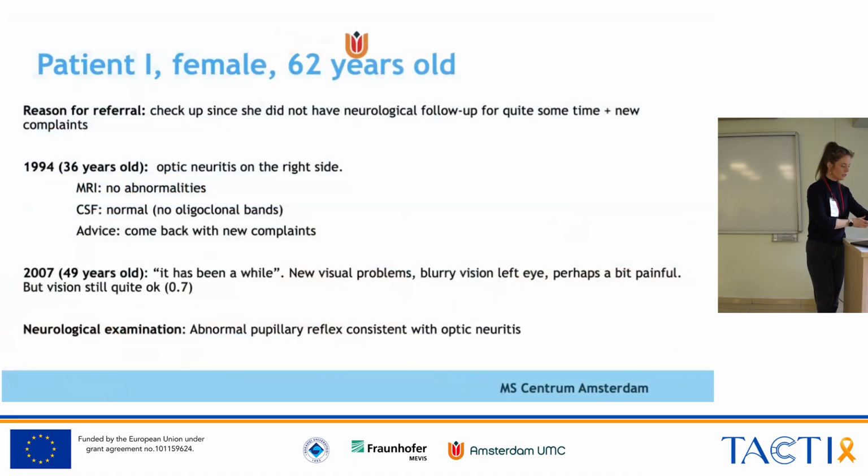One of the last patients, this is a female. She is 62 years old, also a woman, don't know why. And she went in for a checkup since she didn't have a neurological follow-up for years. And she had some new complaints.